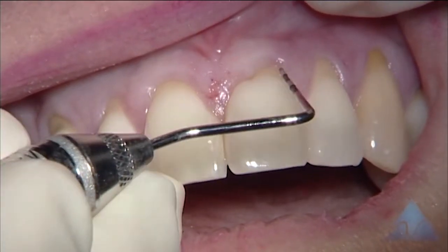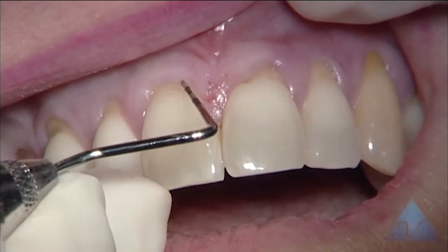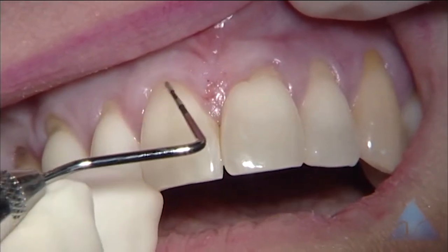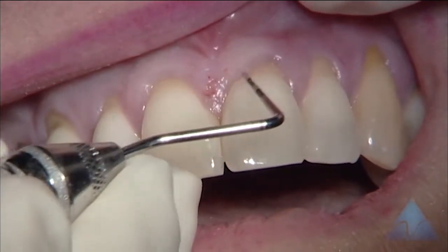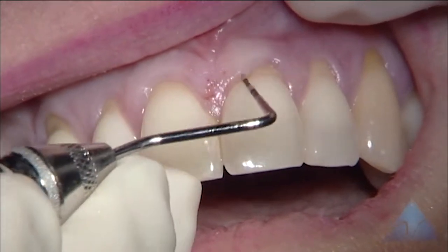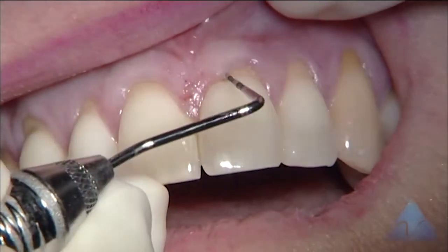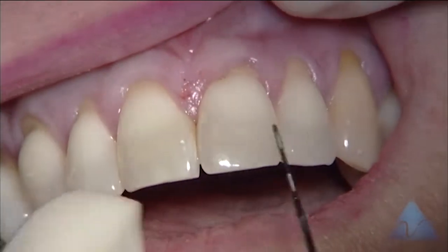You notice there's a little dip in the root surface there, and a little staining here too. Probably have a similar thing over here — a little irregularity that we often see that sometimes creates a little irregularity in the gingival margin. It's just sort of a cleft formation of this tooth.